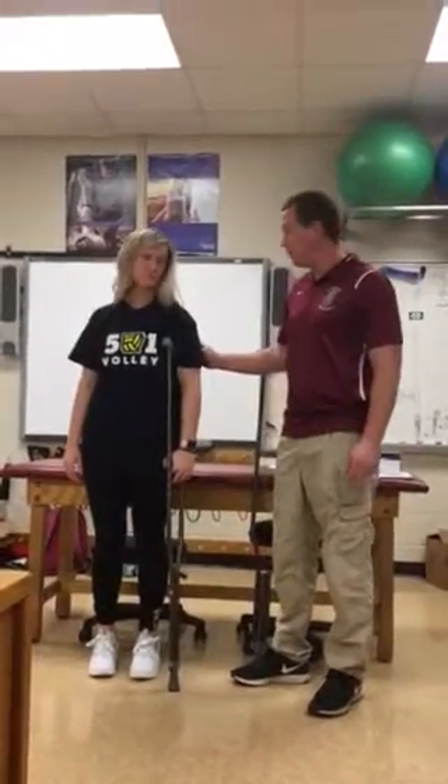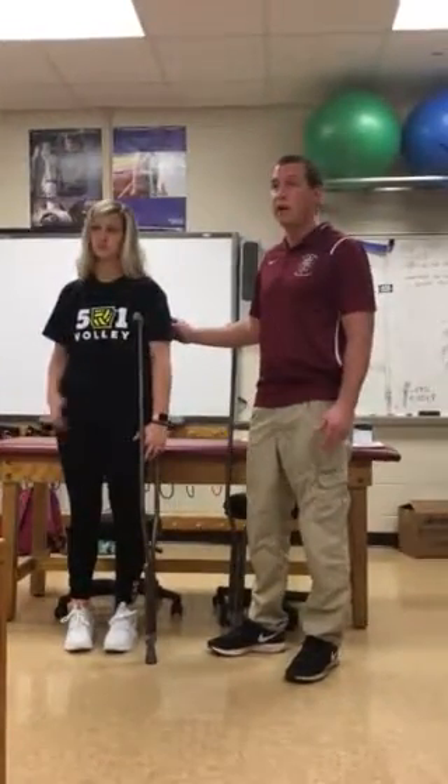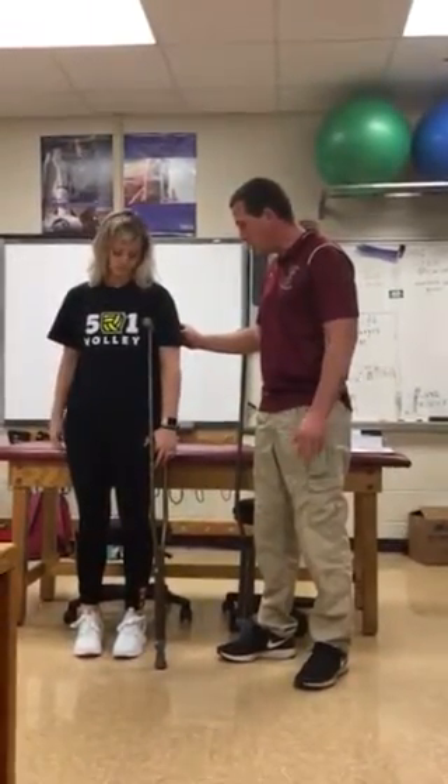If you don't have that much space, or if you have less space than that, then you need to adjust the crutches. Or if you have a lot more than that, then you need to adjust the crutches. 5'10" is actually the right spot for her.